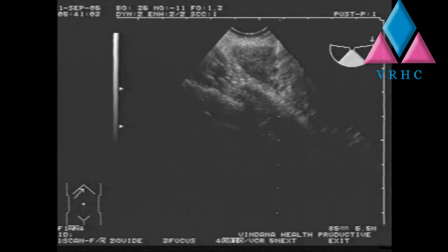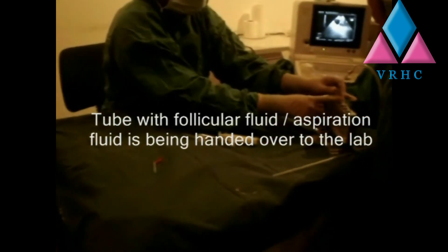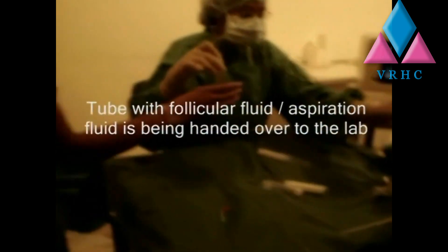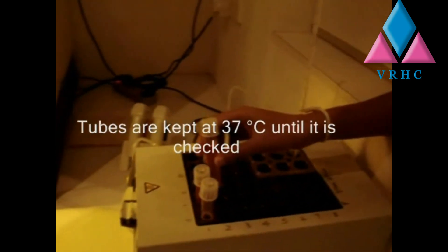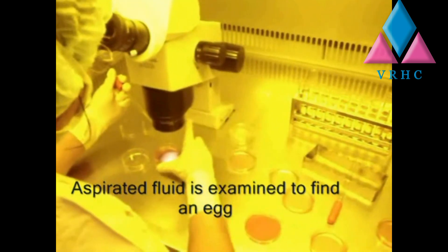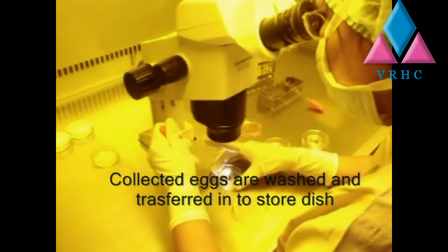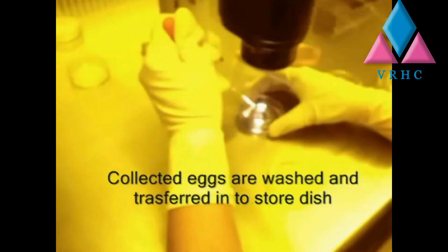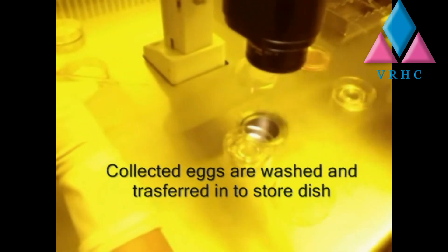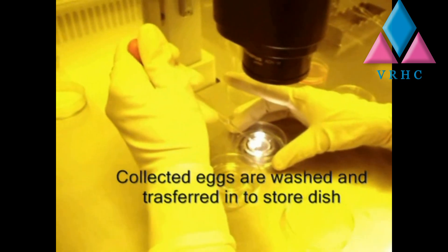Ovum pickup is carried out transvaginally under local anesthesia. During ovum pickup, the follicles are aspirated while gently flushing with warm heparinized solution under ultrasound guidance. The sample is then sent to the IVF laboratory in the attached room, where the embryologist searches for the ovum under the microscope. Aspirated eggs are washed to remove the cells of the corona radiata and transferred to a petri dish. This is a view of a mature oocyte as seen under the microscope.